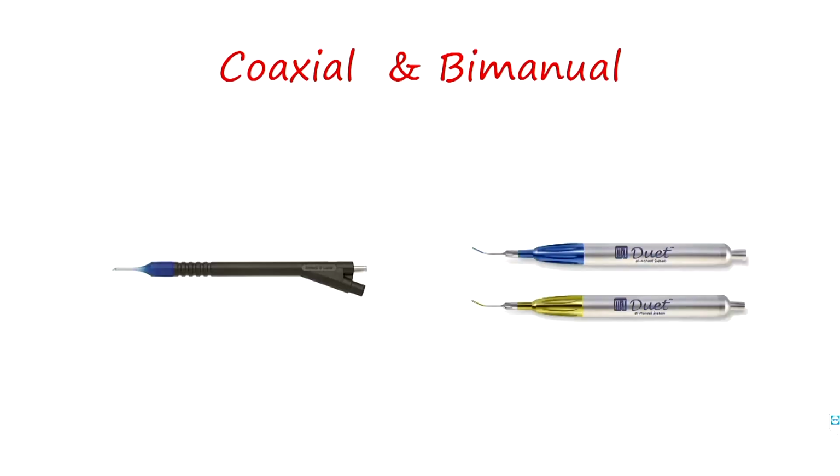You have two types of systems in cortex management. One is coaxial and one is bimanual. Now the most popular one is the bimanual, but unfortunately I don't use bimanual, so I am going to show you only the coaxial system, which I have been used to for the past 25 years.